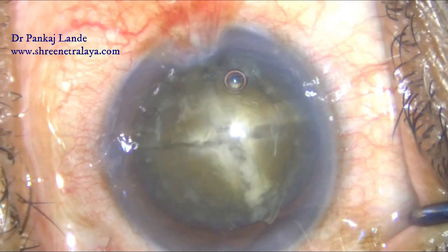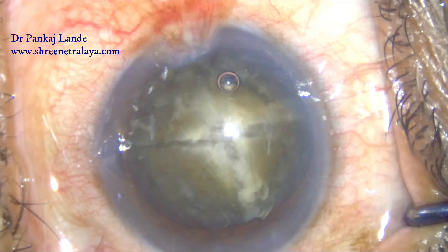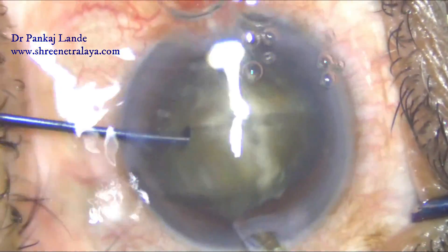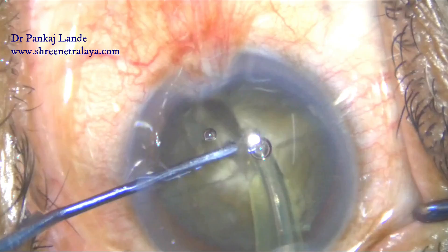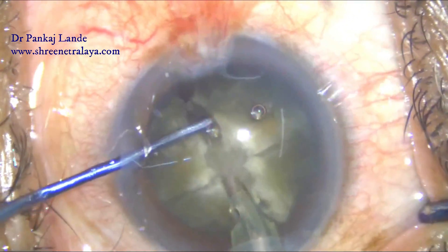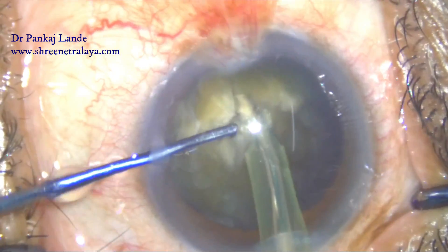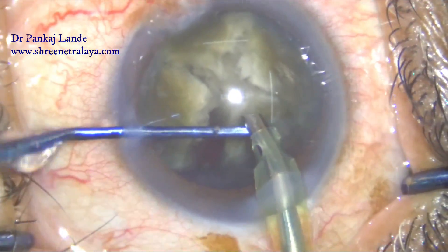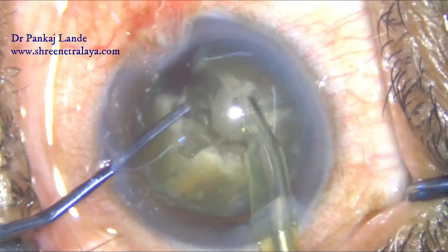Keep the anterior chamber well-formed. If you have a shallow anterior chamber, you need a bit of patience when using the pre-chopper, as it takes more time than normal phacoemulsification. But it will definitely help in cases where the corneal endothelium is at risk. Once the nucleus is divided into four pieces, I proceed with the routine phacoemulsification procedure.